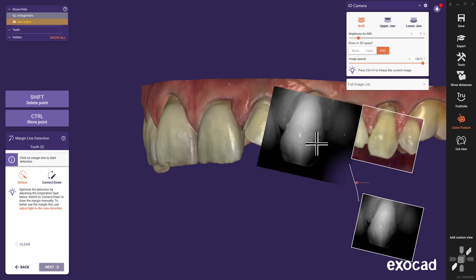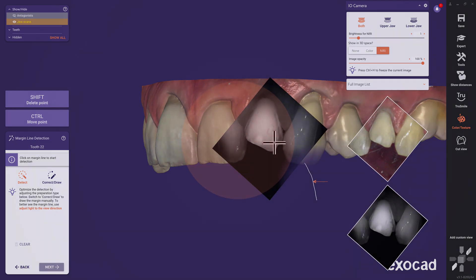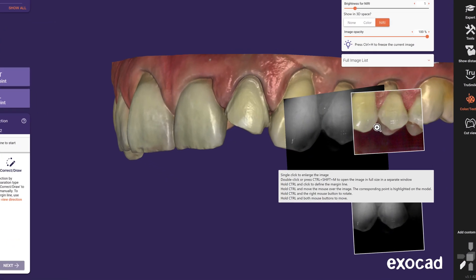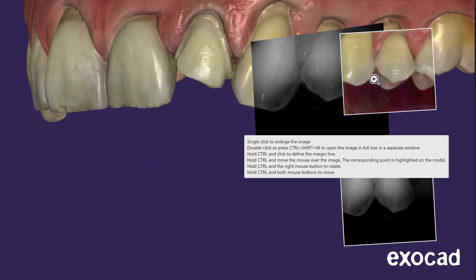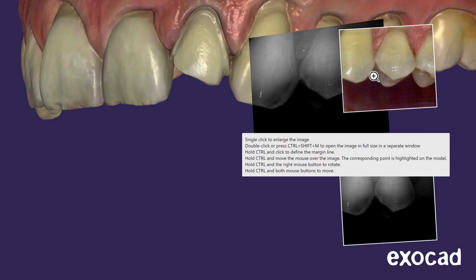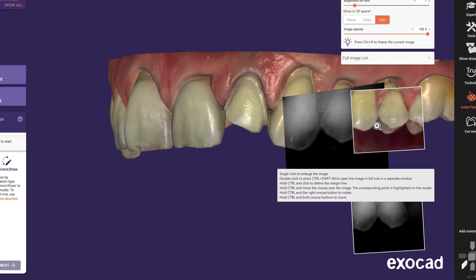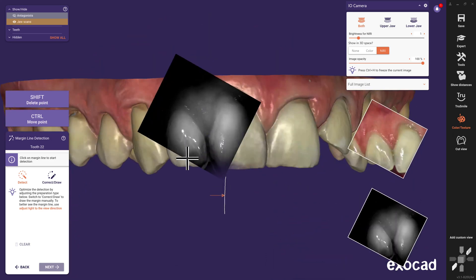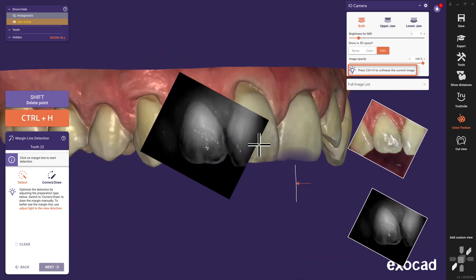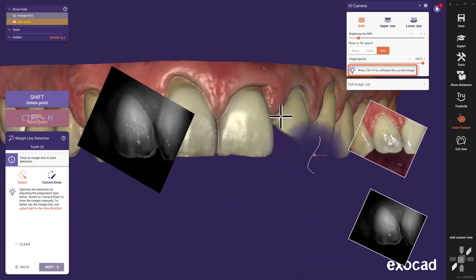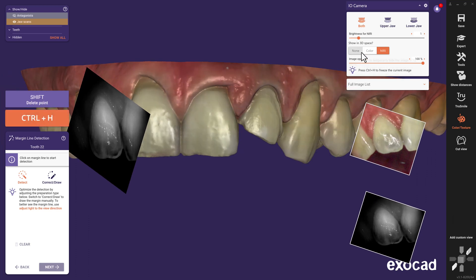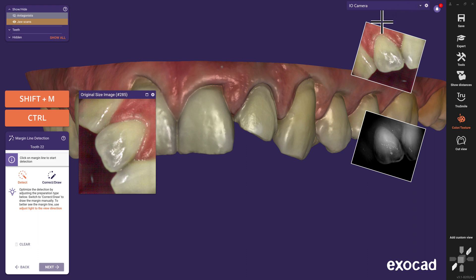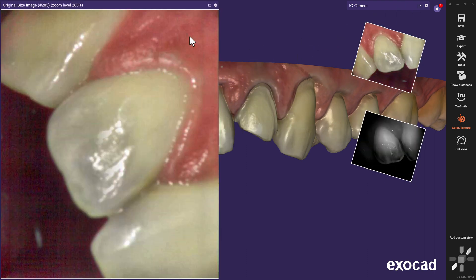This improves your design and choice of material for the final restoration tremendously — you will absolutely love this feature. We implemented specific shortcuts for this tool. To display them, just place your cursor for about a second over one of the images and a tooltip will appear. Try CTRL H, for example, to freeze and unfreeze the position of a meaningful image. And CTRL SHIFT M will open the original size image in a separate window.